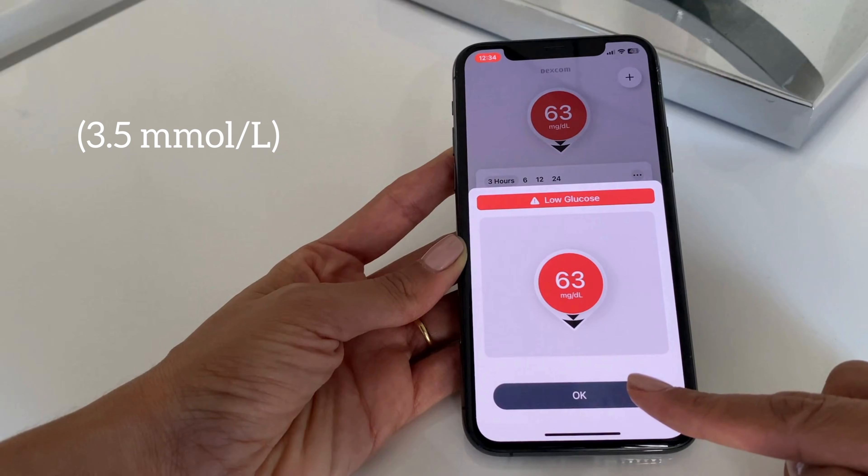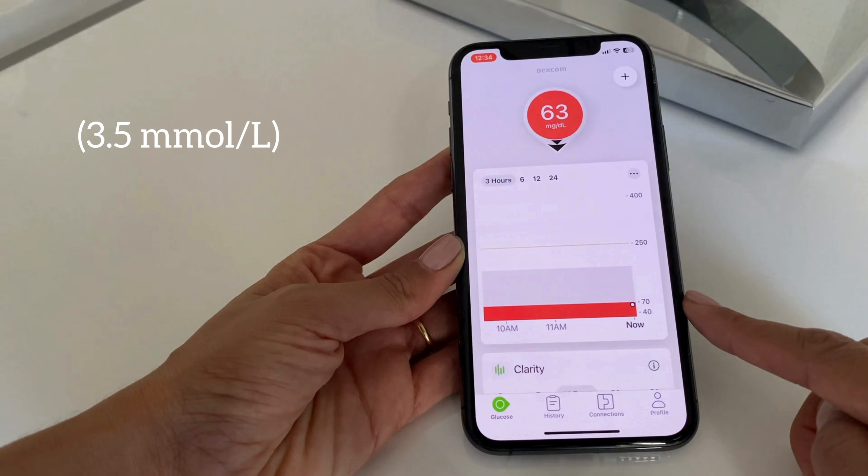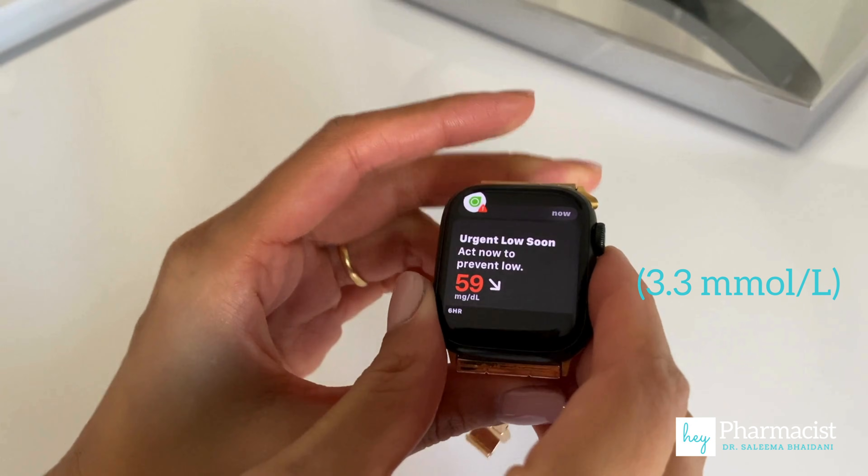I have a low glucose reading — nice firsthand experience of what the alerts look like on this app. As I mentioned, the Dexcom also pairs with the Apple Watch. I've just gone in to see what that looks like, and my low reading is also here. It looks like there's an arrow going down, meaning it's about to get worse, so I'm going to go eat.